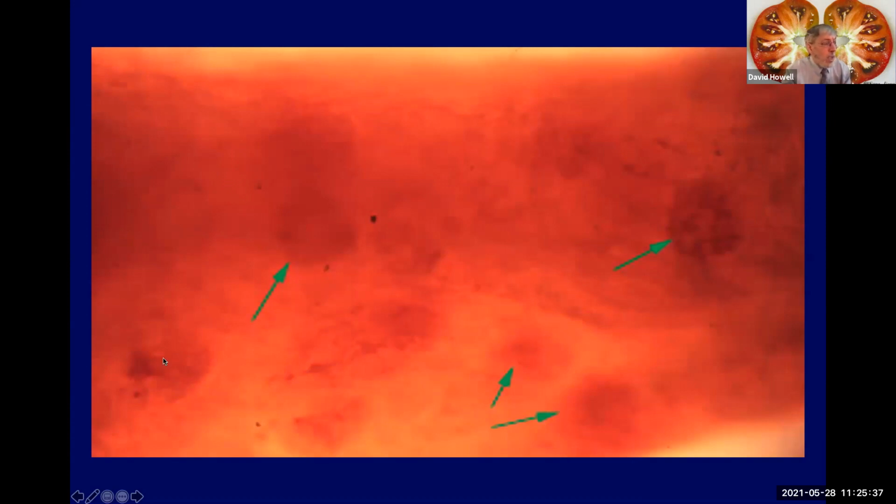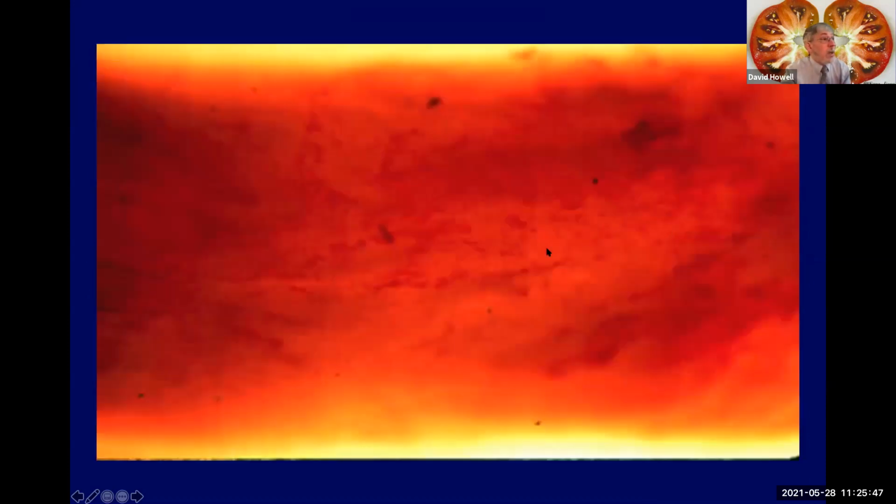The glomeruli, I've shown you, are very vascular structures, and when the biopsy is taken, there will be blood in the glomerular capillary loops. And so the glomeruli show up as these little cherry red blobs. This, in contrast, is medulla. We see these long, straight vessels, but no glomeruli.